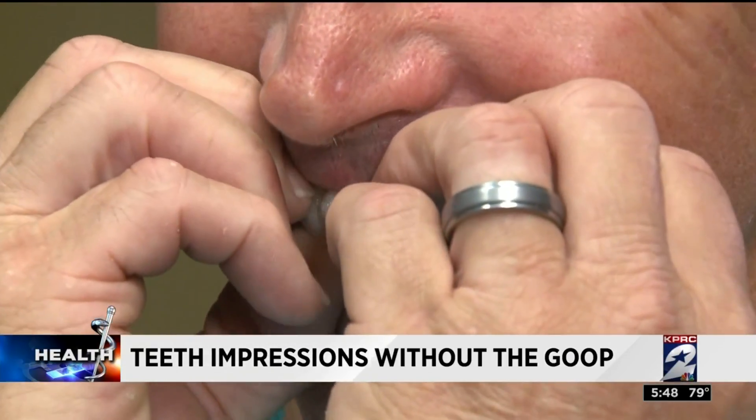We're really at a boom in the kind of things that we can do in dentistry. The cost is the same to patients with this scanner. There may be times dentists will still need to use the regular impression materials, but the doctor says he's getting to the point where they don't need regular impressions.